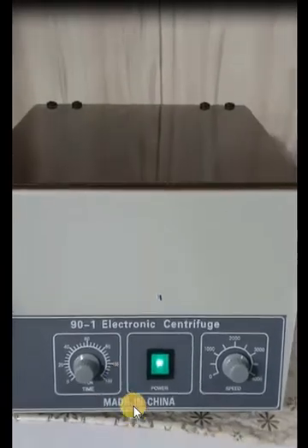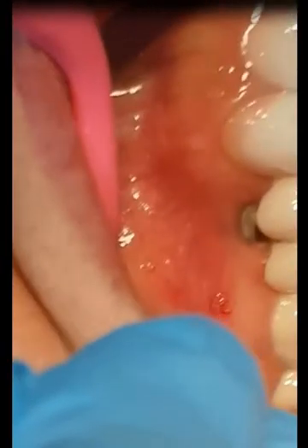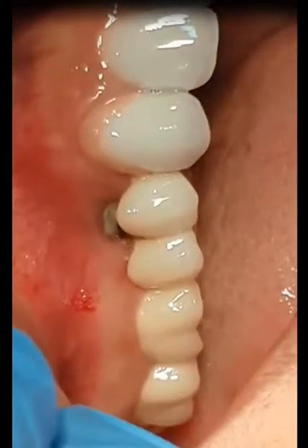Here is the centrifugation. And this is the defect. We have a case that has a gingival recession, mobility, and a cortical and buccal cortical bone loss.